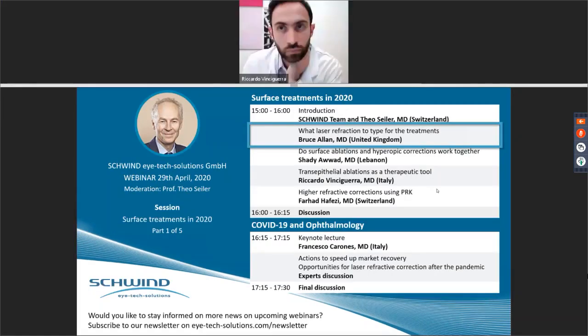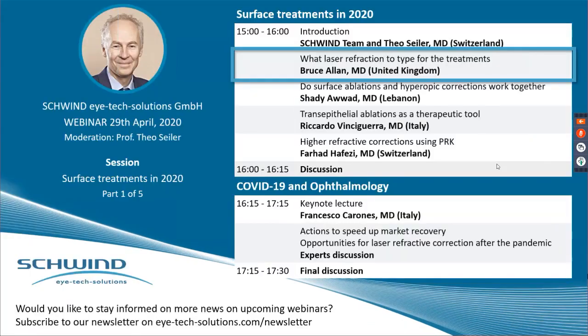Yeah, so first, I would like you, Bruce, to clarify the problem we had during our last user meeting. I was used to dilate the pupil for the wavefront measurements, but you are not doing that. And I think you should be a little bit more concrete about that so people understand that you don't use tropicamide to dilate the pupil, do you? Yes, no, we are doing it undilated, and so we are doing the wavefront scans in mesopic conditions with the room darkened with no dilation.